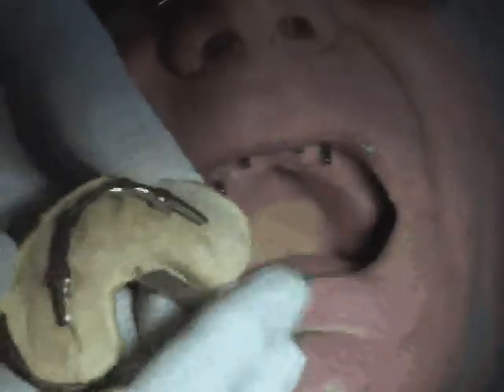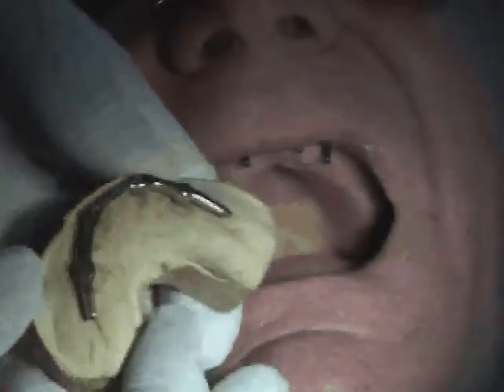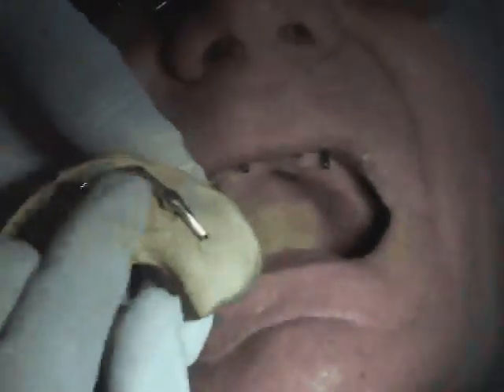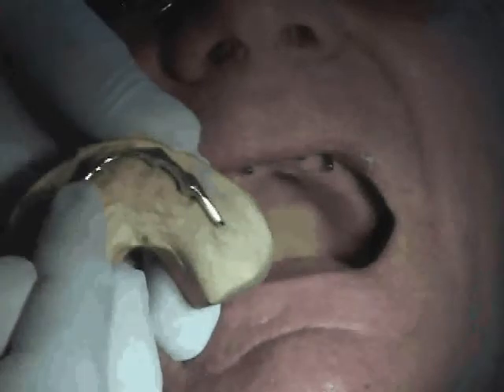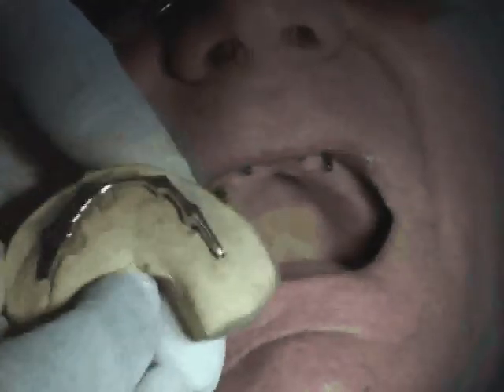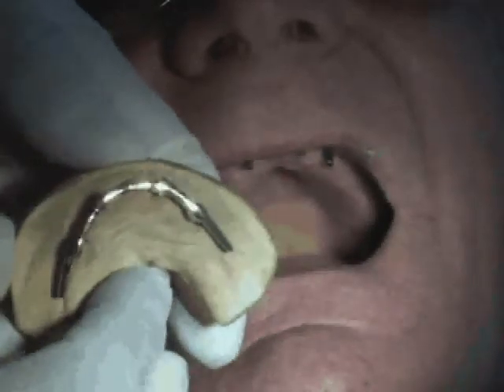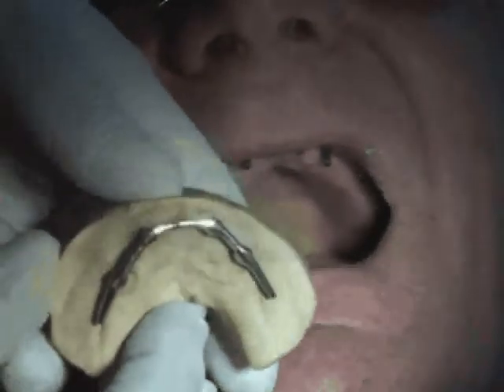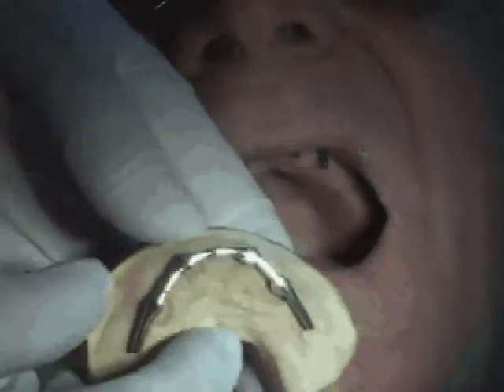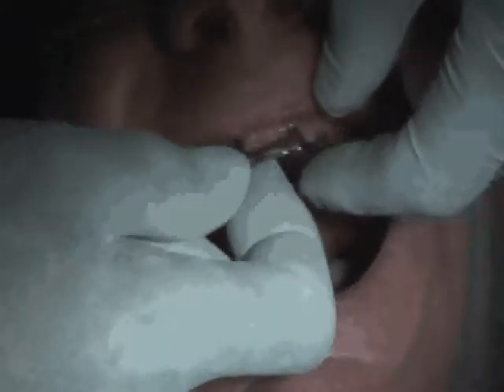The maxillary overdenture impression is done without cementing the bar superstructure onto the abutments. This saves time during the overdenture construction. If the bar is cemented, it is necessary to grind out the soft liner and hollow grind the temporary denture to fit over the bar. If the bar is not cemented, then the bar will come out with the impression. Remove the hydrocolloid material from immediately under the bar, remove the bar, and then pour up the impression.